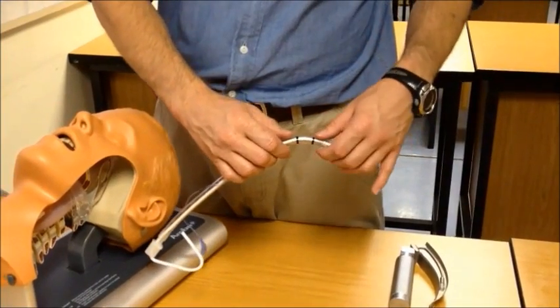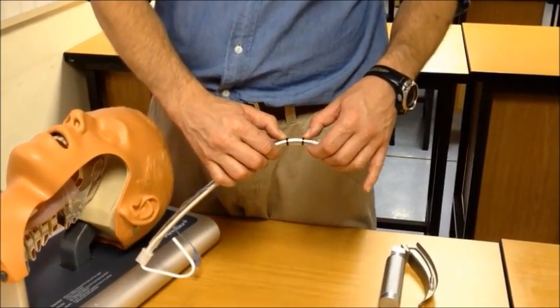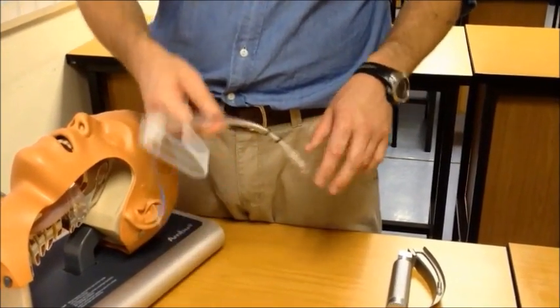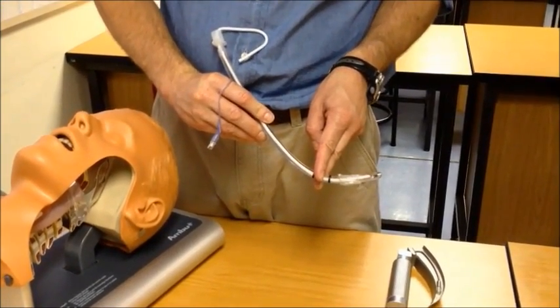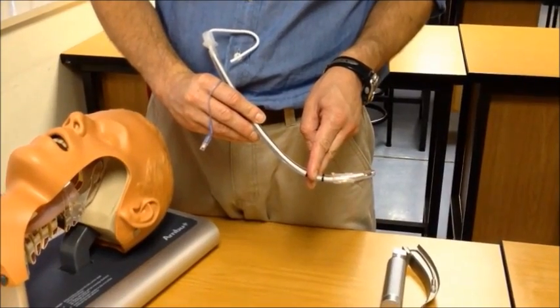On this particular ET tube, please note these two dark markers called the vocal cord markers. When intubating, it is prudent to allow the vocal cords to rest between those two, giving added visual feedback on correct placement of the tube.